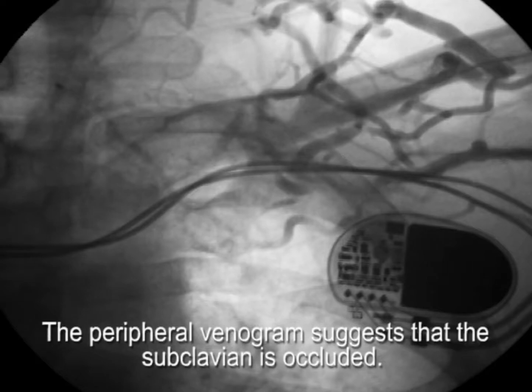When preparing to add a lead to an existing system, oftentimes a peripheral venogram is performed. This suggests that the vein is occluded, as in this case, with extensive collateral formation.